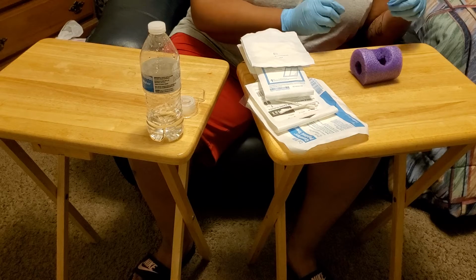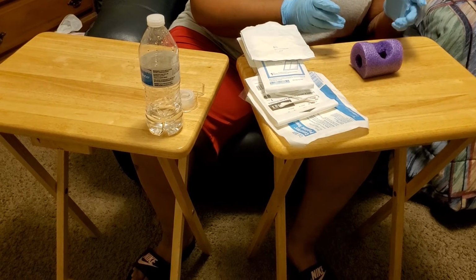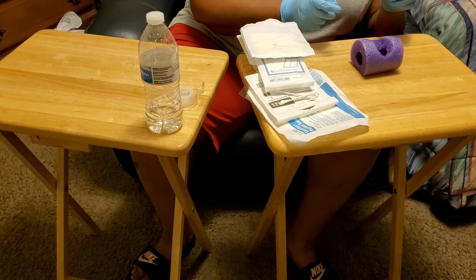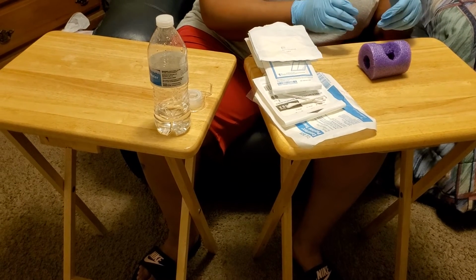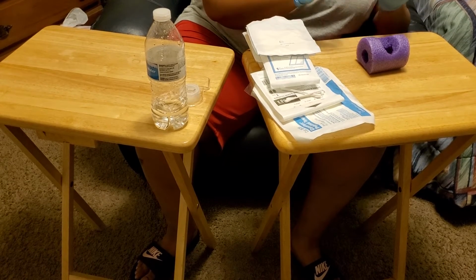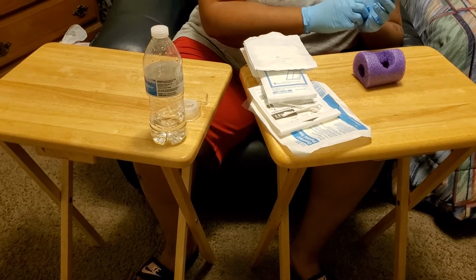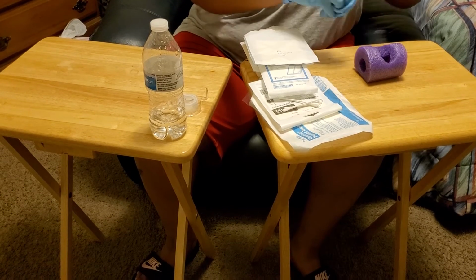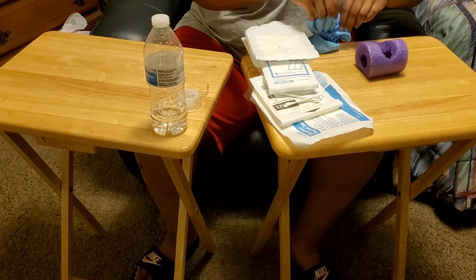And while I'm taking the dressing off, I would want to check over what the previous nurse did, making sure that the layers are correct. So making sure that the ABD pad is on top, the 4x4 gauzes are underneath, and the wet gauze is packed into the wound. All right, so after I do that, I would want to take off the clean gloves like so, and I would dispose of those.